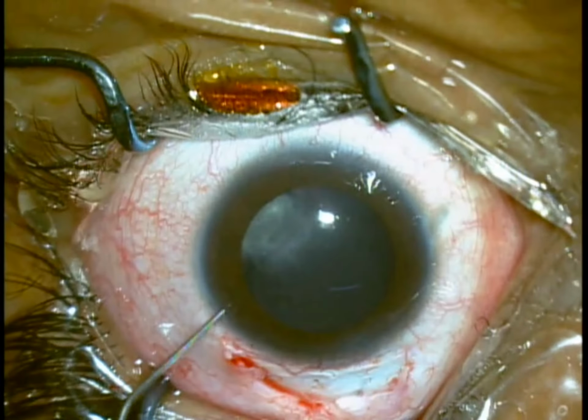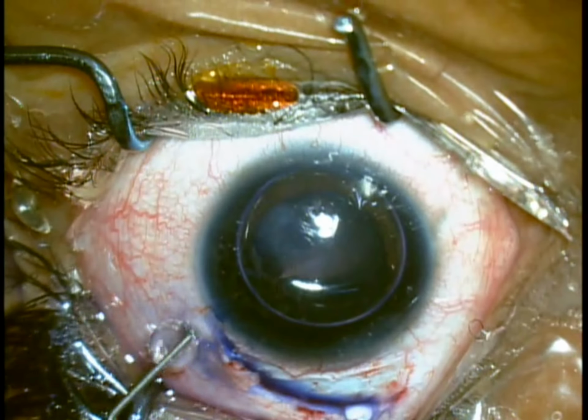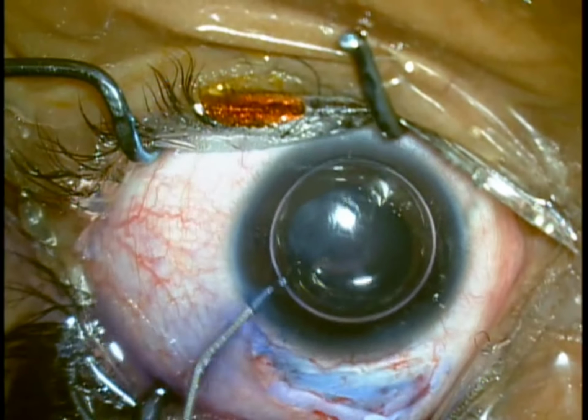A side port was made at 2 o'clock position. A continuous curvilinear capsular rhexis was begun after staining the anterior lens capsule with trypan blue.